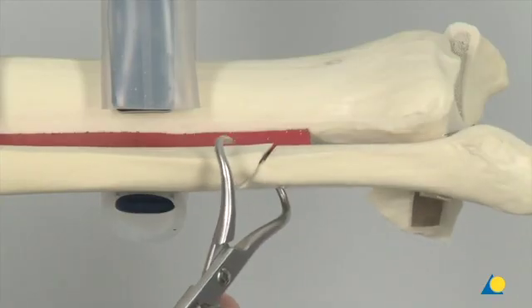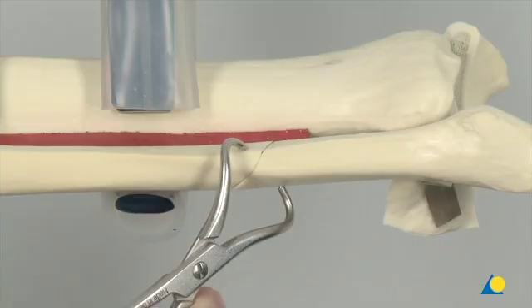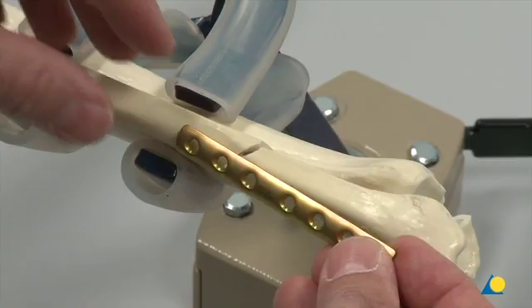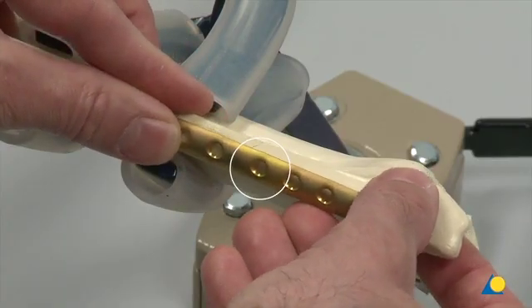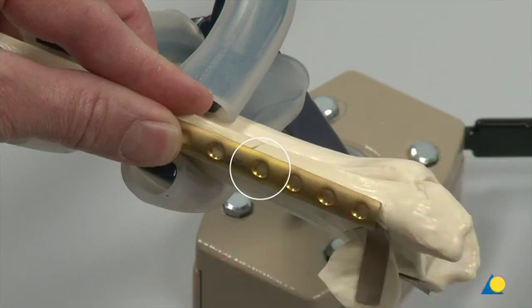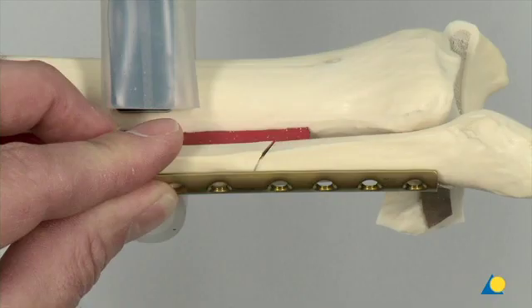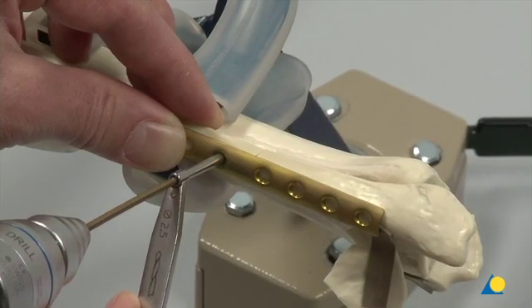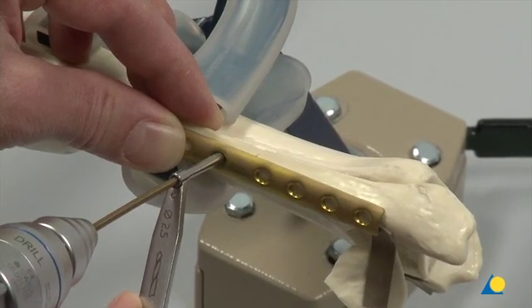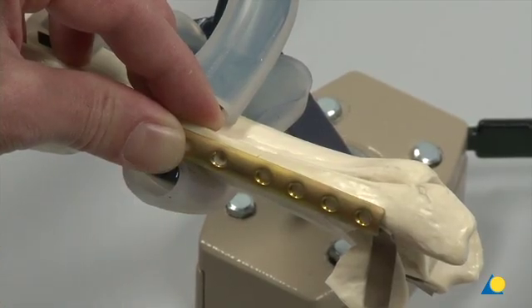Clinically, the pointed reduction forceps would be used to reduce the initial fracture displacement. The 7-hole LCP 1/3rd tubular plate is placed onto the bone with the middle hole distal to the fracture. This hole will be used for the lag screw. Contouring is not necessary. A neutral hole is drilled through the third proximal plate hole, close to the fracture, using the 2.5 mm drill bit and 2.5/3.5 universal drill guide.